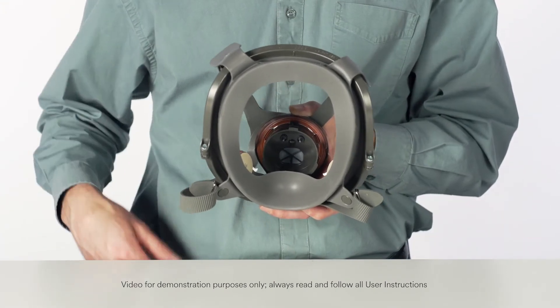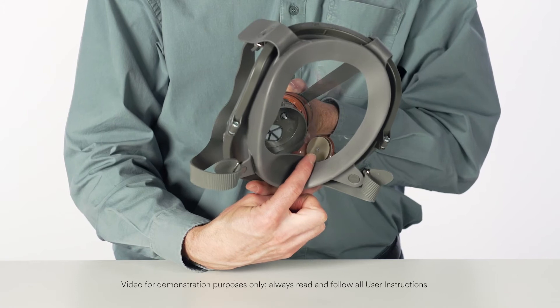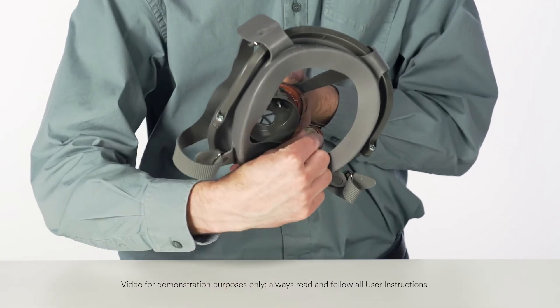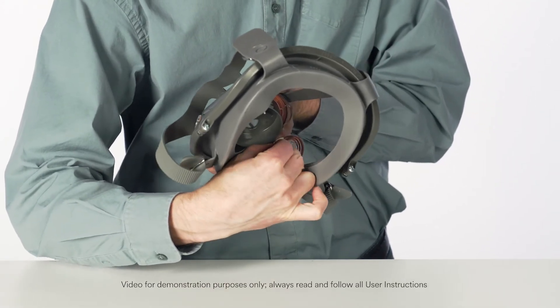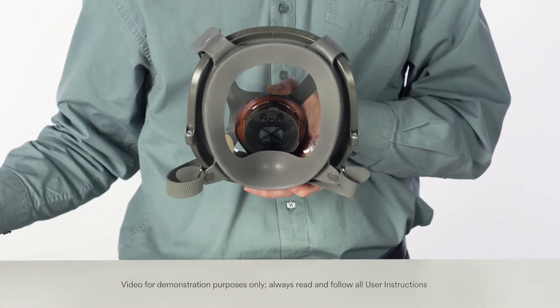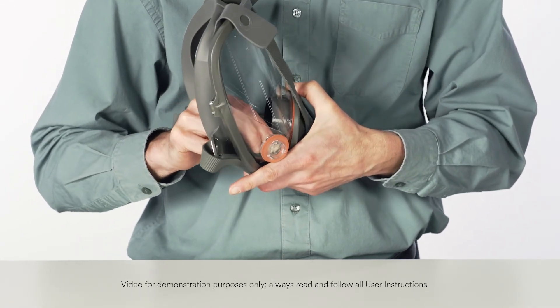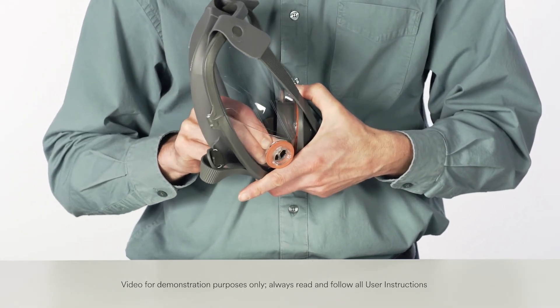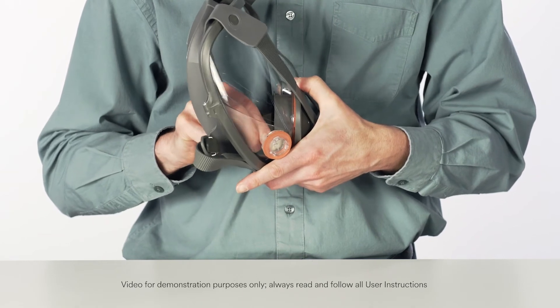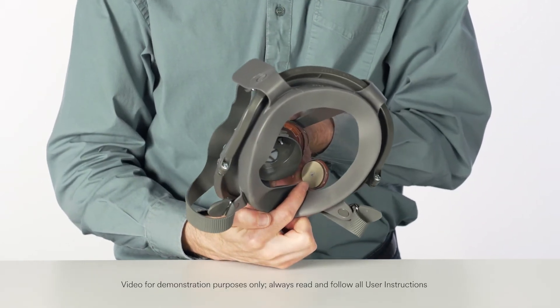Make sure the nose cup is firmly seated under the center and side tabs. Inhalation valves are located inside the nose cup and inside the lens. Remove the existing valve by lifting from the post. Install a new valve onto the posts. Be certain the valve is fully engaged under all three lugs on the post, lays flat, and spins freely.